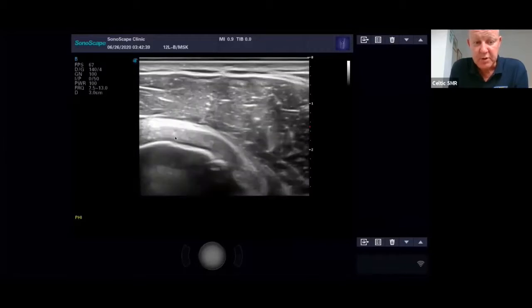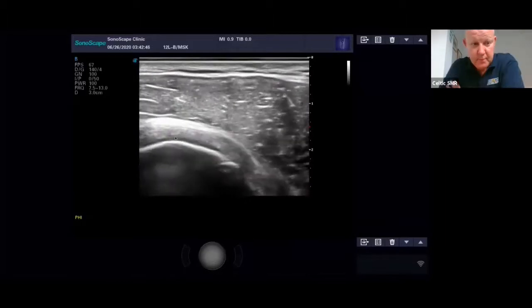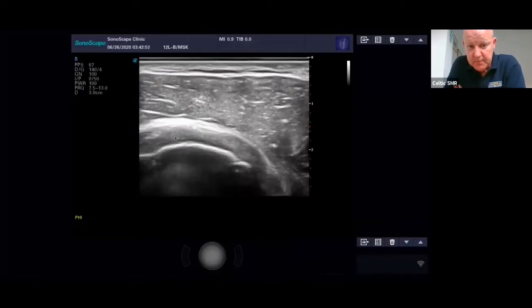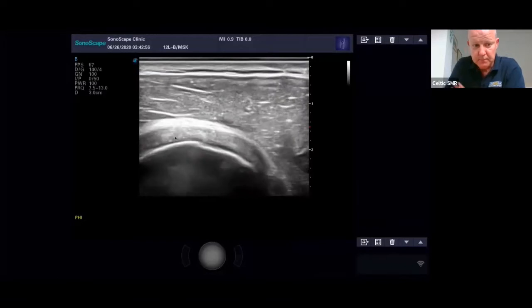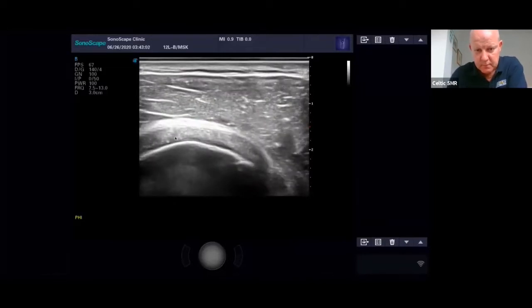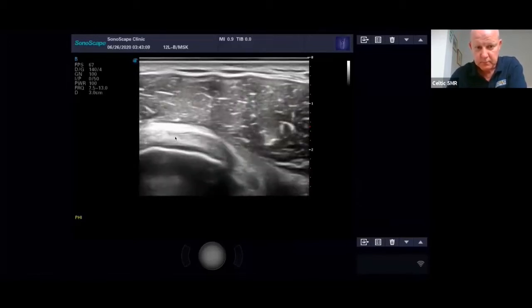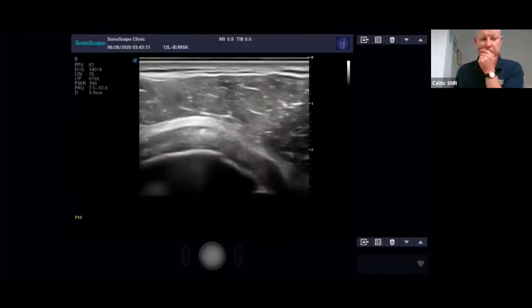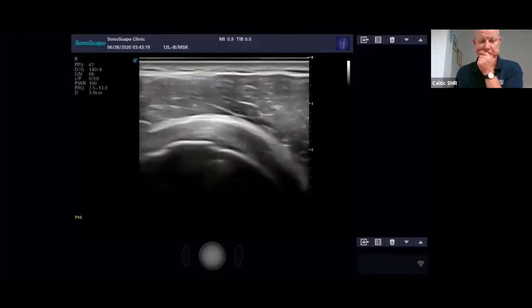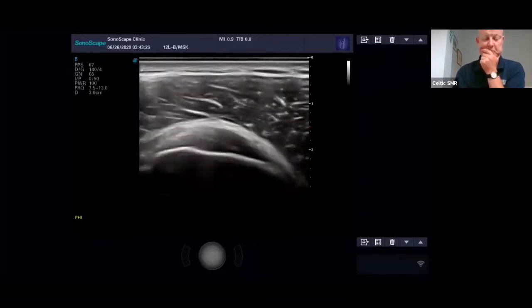Do you use the Doppler much when looking at the shoulder? I don't, only if they're querying frozen shoulder. You can put the Doppler around the rotator interval, around the biceps tendon, and if there's any Doppler around there, that can be a soft sign for frozen shoulder. You can put it on the tendon to see if there's any active tendinosis within the tendon. I don't see that often, to be honest. Biceps tendinosis, you'll see some Doppler around the biceps. I'm going to go over the biceps in a couple of weeks anyway, the long head and the distal attachment.